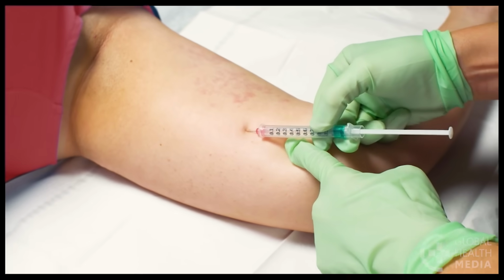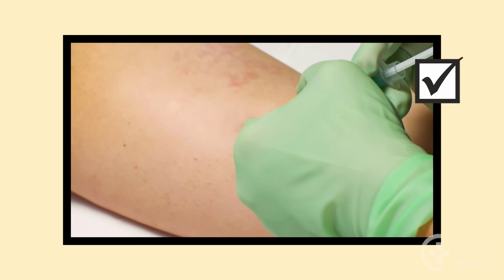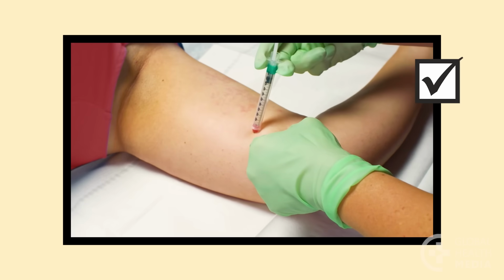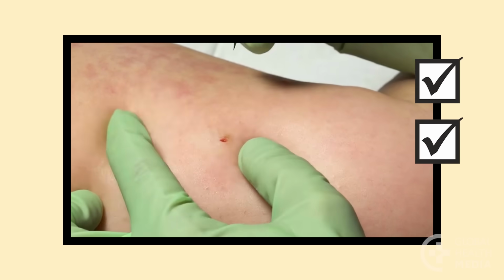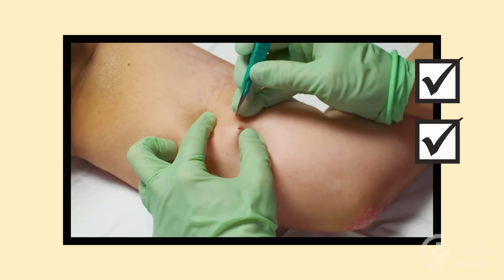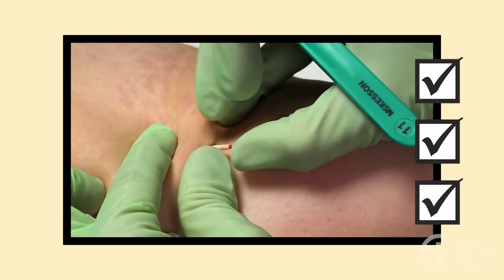Remember, the anesthetic goes under the tip of the rod. Make a tiny incision. Use the approach that causes the least damage to the woman's arm.